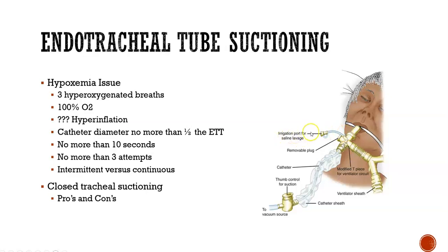This is where they can lavage if needed, and we basically just pop this off, put the ambu bag on, and they can instill sterile water, sterile saline into here and lavage and try to bust up plugs and stuff.